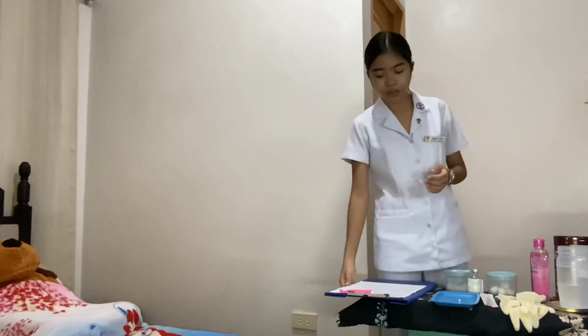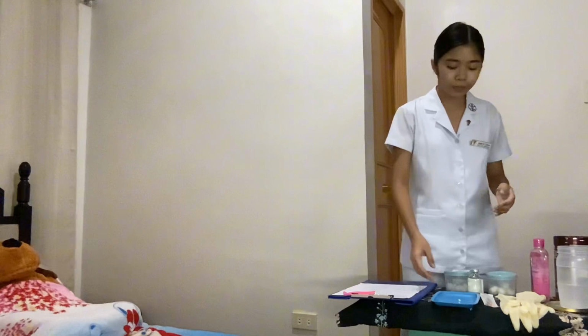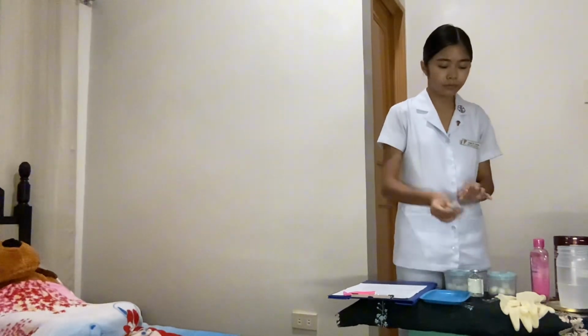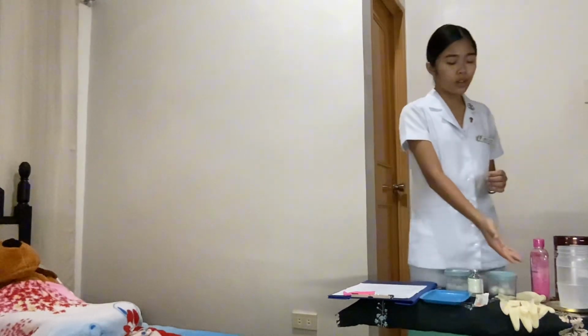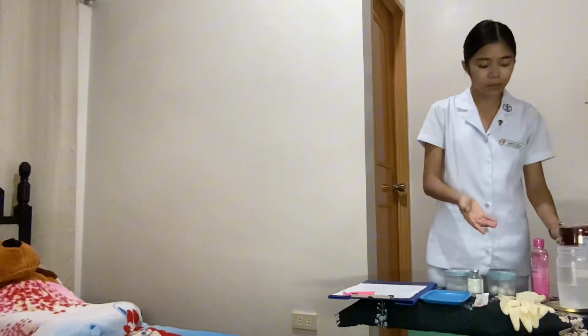Then the next thing you're going to do is to organize the equipment that we will be needing as we go on to the whole procedure. First, we already have the doctor's order and the MAR here. We also have the medication ticket. We also have the medicine tray here. We have our insulin syringe, our clean gloves. We also have our trash receptacle here, including the sharps receptacle.